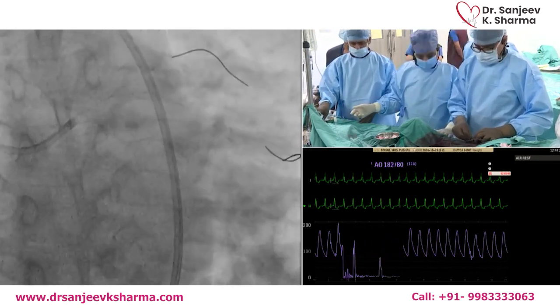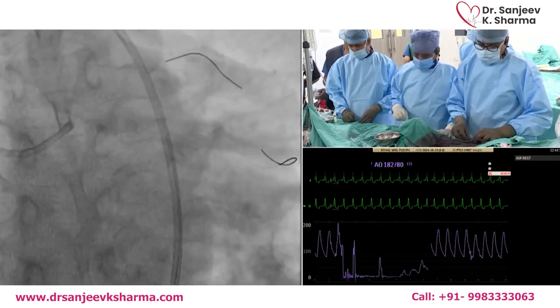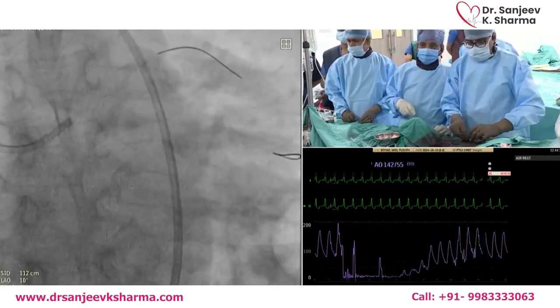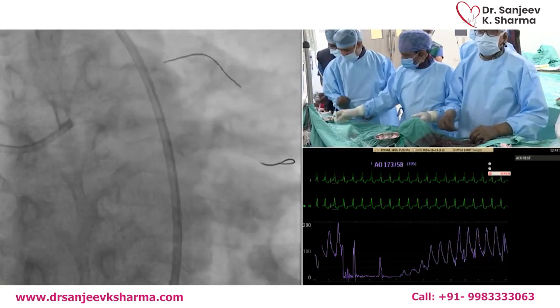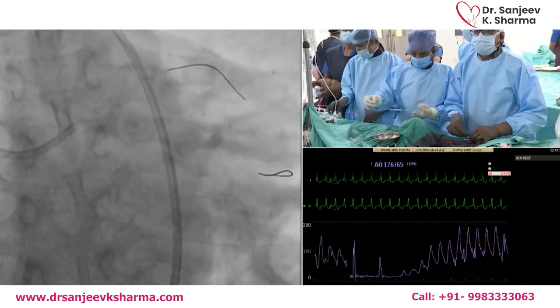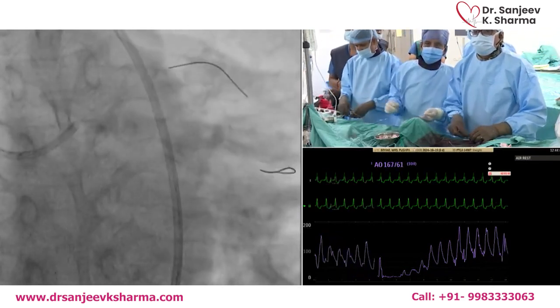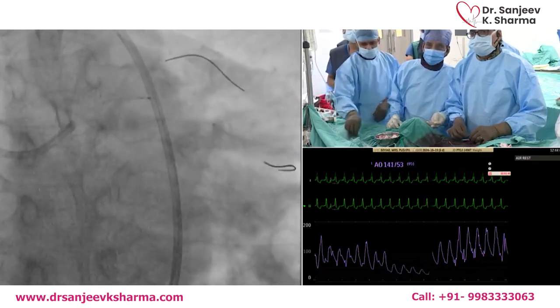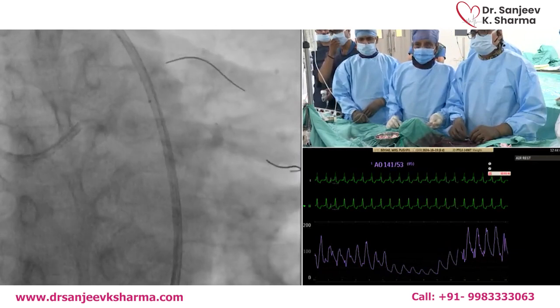Yeah, I have a question here. In larger vessels like left main and ostial LAD, rotablation has to be complemented by IVL or at least a cutting balloon or AngioSculpt. Do you think if we use orbital atherectomy, the chances of needing these complementary techniques are less? Does it work better than rotablation in larger vessels?